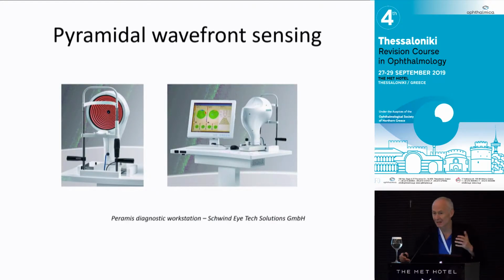Customized treatments. As you know, these days we don't just routinely drive laser vision correction treatments with manifest refraction alone. That's not the only option, at least. We also can use wavefront sensors to create an optical map of the eye, and you can design a treatment and then print that treatment back onto the cornea with modern tracking systems and treatment registration systems.